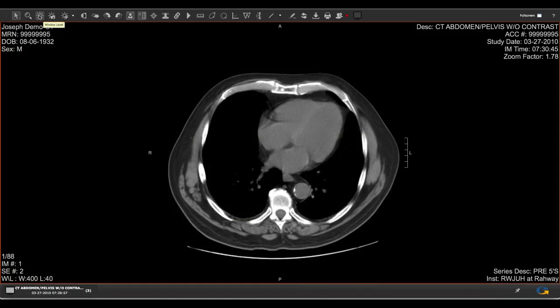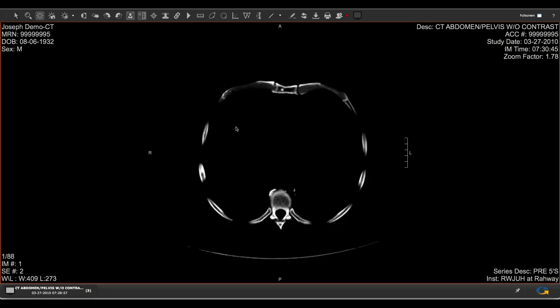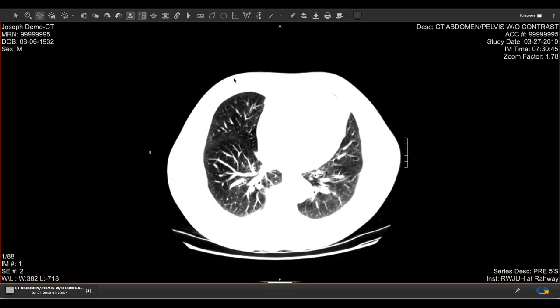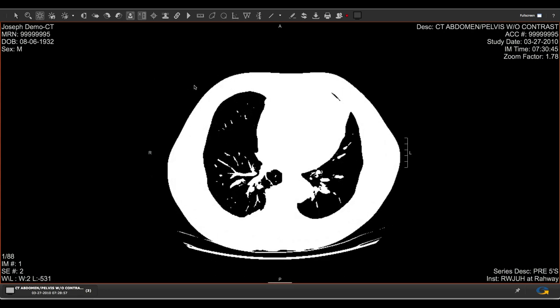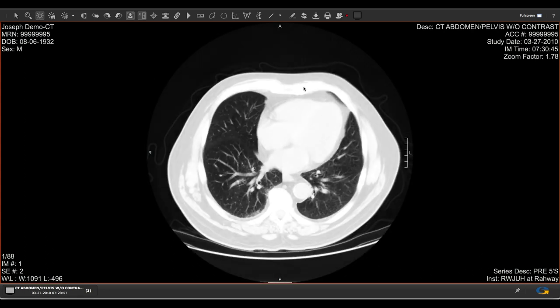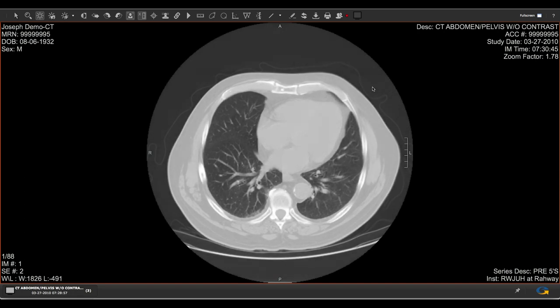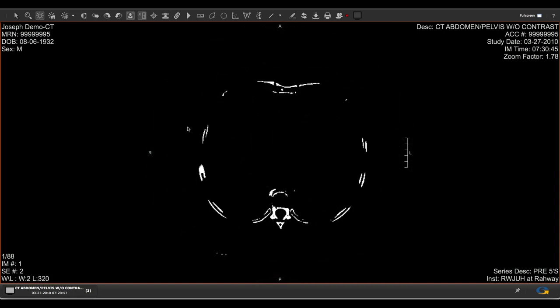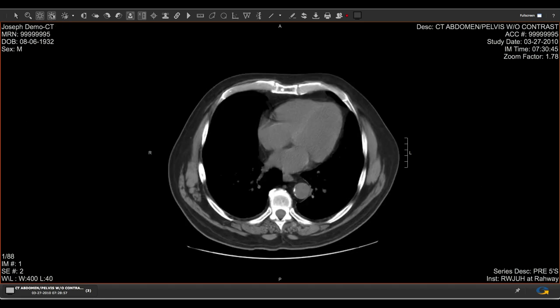Brightness and contrast can be adjusted by selecting the Window Level button. After selecting it, click on the image of interest and drag your mouse up and down or side to side to change these parameters. Click the button immediately to the right to return to the original default exposure.